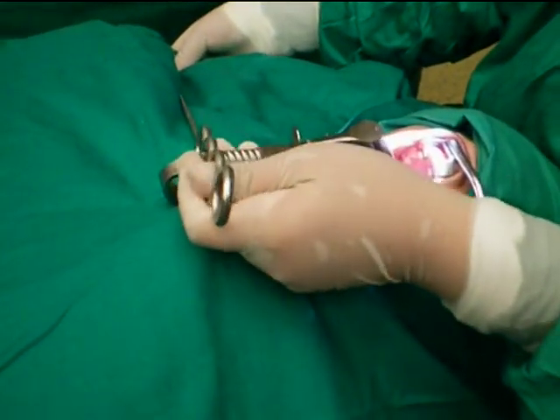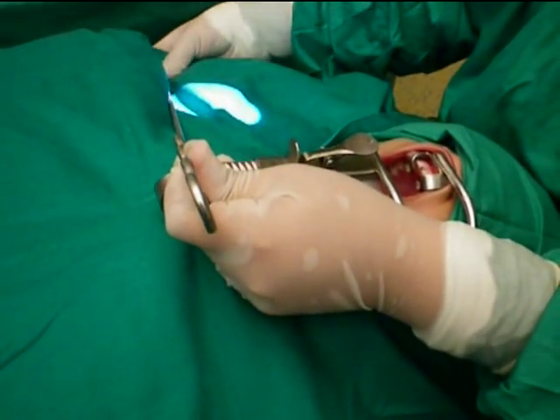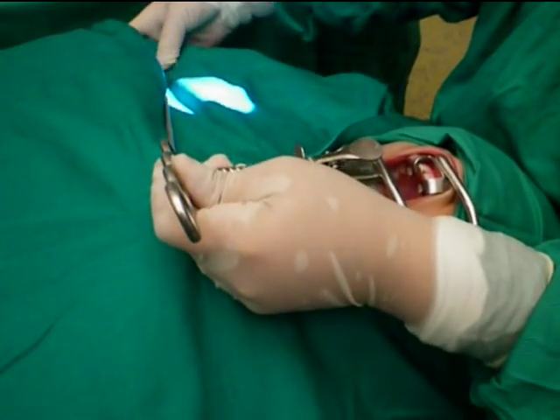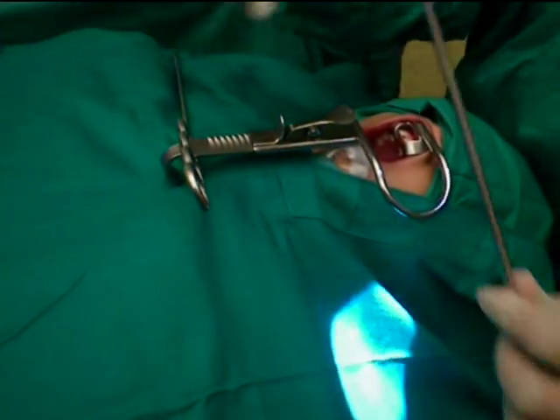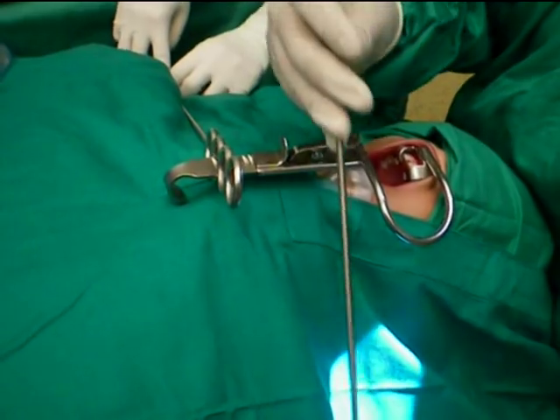When satisfied with the positioning of the mouth gag, apply the Drafin Bipod rods onto the edge of the mouth gag blade, using the appropriate hole or circle for optimal stability.